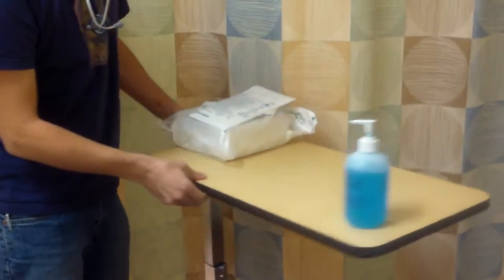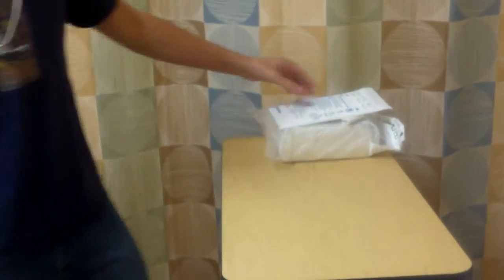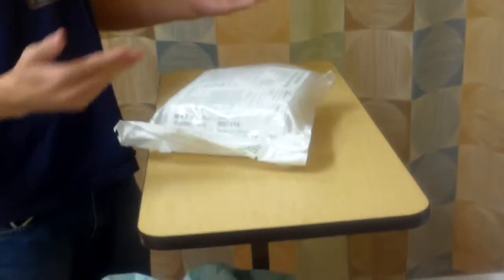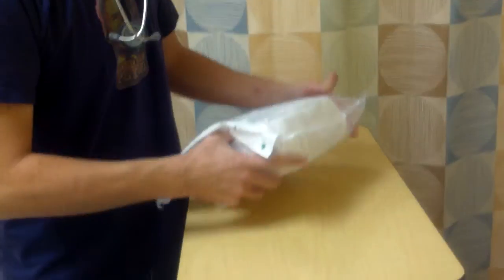Make sure my table's in the right way, so I'll do it this way. Okay. I'm just going to move this here. Next pair of gloves, just in case. And see the table? There we go. So then, my package: expiration date's good. Integrity is good. Open it.